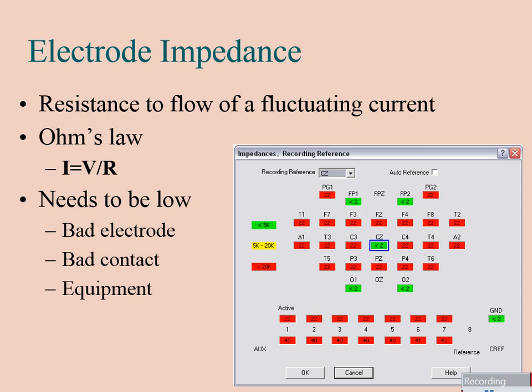So usually the first thing we always really should do is check the impedance of our electrodes. And again, the modern equipment does that for us, and we want very low impedance, less than 5 kilo ohm. If the impedance is high, either we haven't placed the electrode very well, we don't have it in the skin well.